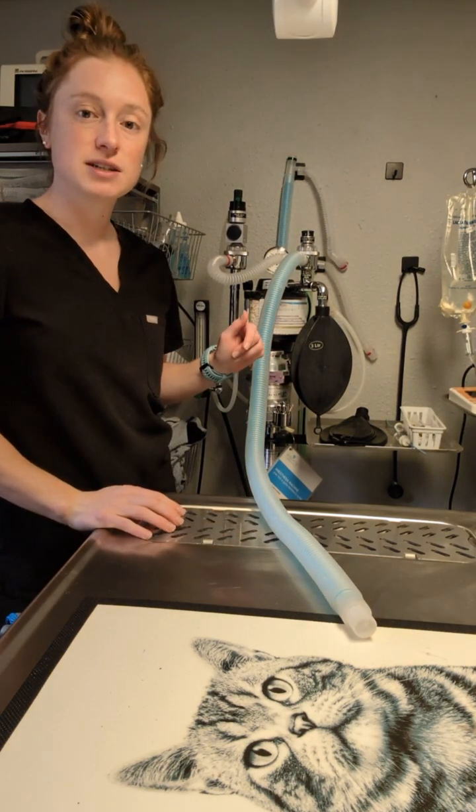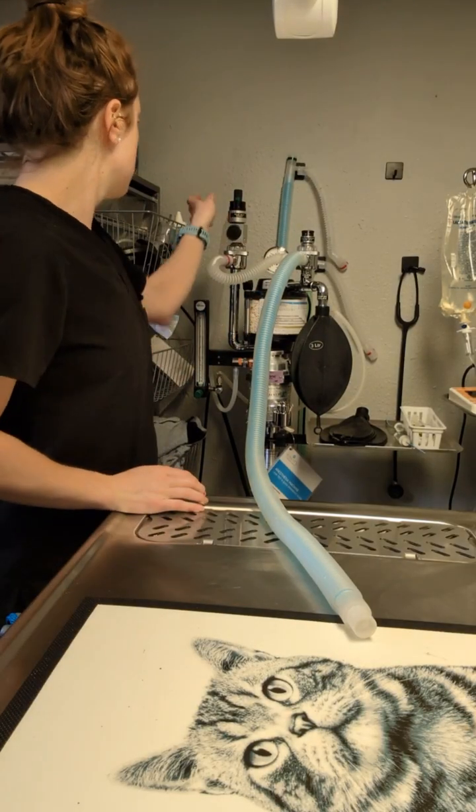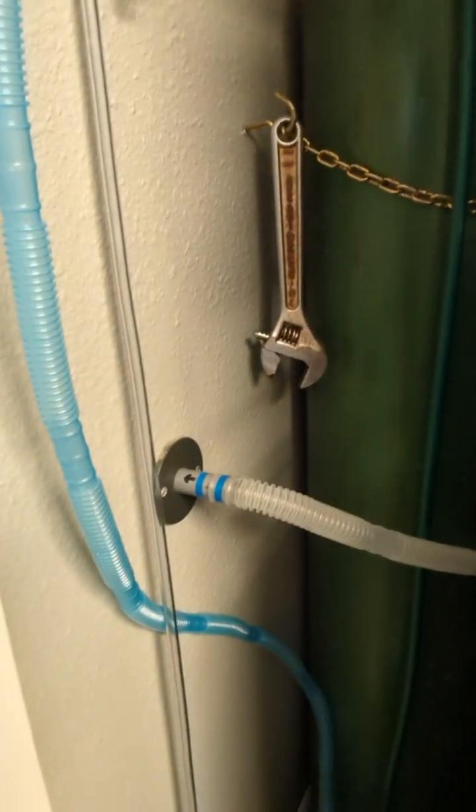Our scavenging system is just a passive system that goes to the wall vent. So again, it goes through this tube in the back. It goes behind our anesthesia cart, and it goes just out into the outside world.